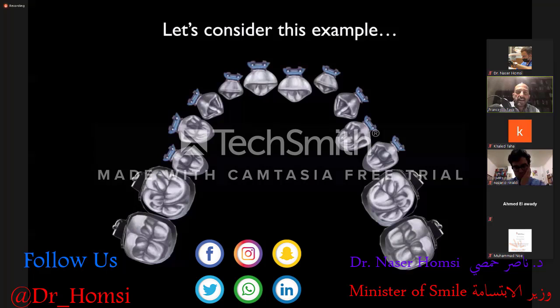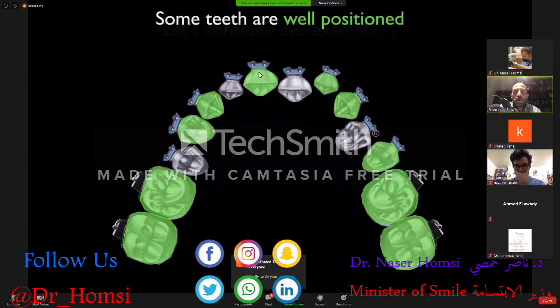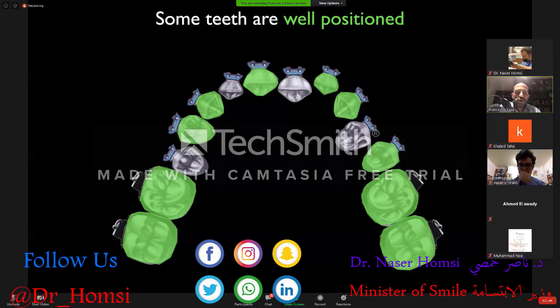And now let's go back to the initial example we did when considering a continuous aligned arch wire, and let's do some consideration about the initial positions of the teeth. We may imagine that there are some teeth in a good initial position, such as the teeth colored in green. We have molars, some premolars, some canines, and 2 incisors in a good initial position. So a question could be, do we really need to move them?